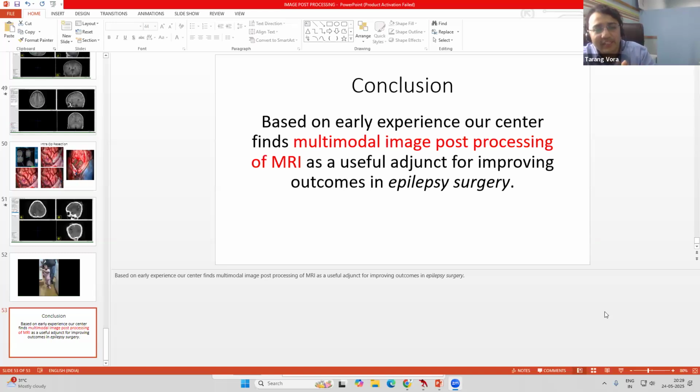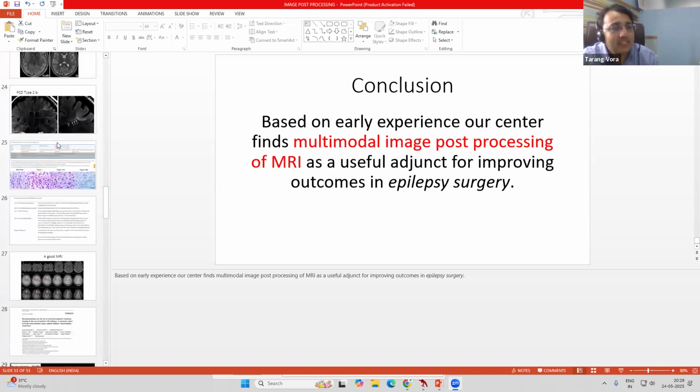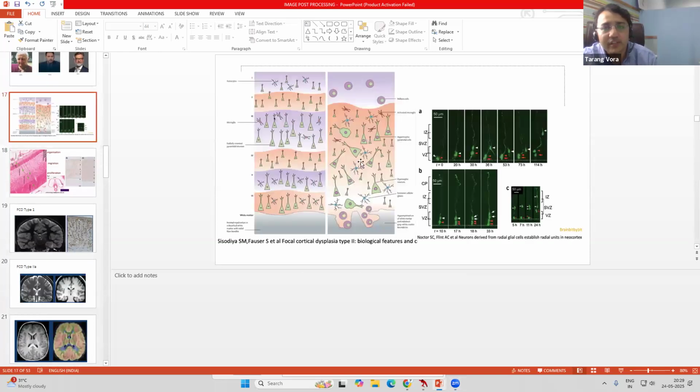So we have that gray-white matter zone, which is slightly blurred and not having that sharp contrast between gray and white. Then we have some thickening of the gray matter, yes, because the cells are slightly bigger in size. As I showed you in one of the slides earlier, the cells are dysmorphic and larger in size. Their uptake of the FDG is different from the uptake of FDG in the normal cells. These are large cells and balloon cells. These are dysmorphic cells.